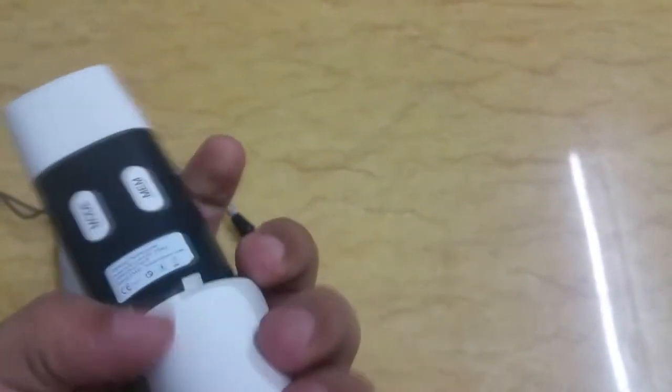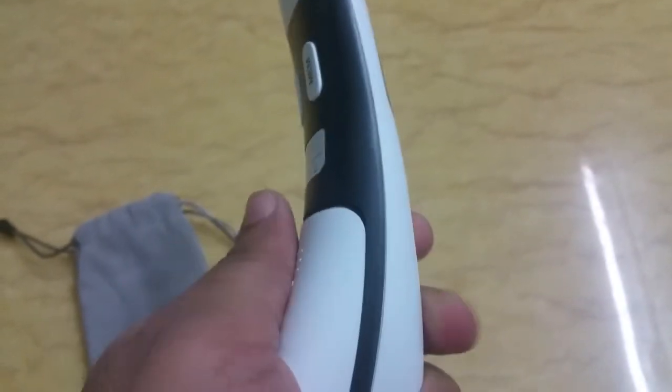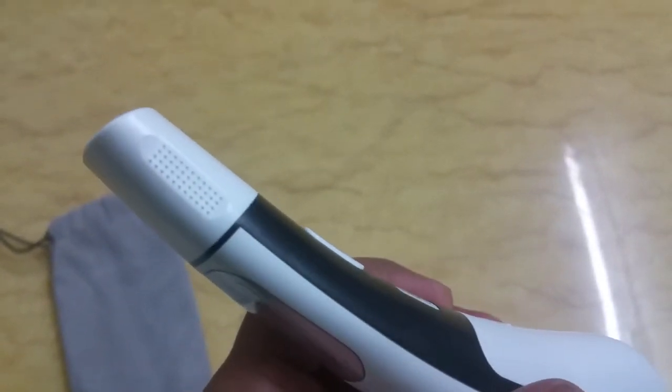You can slide the bottom part off to expose the batteries. It takes two AAA batteries, and batteries do come in the package, which is nice, so you can use it immediately after unboxing.